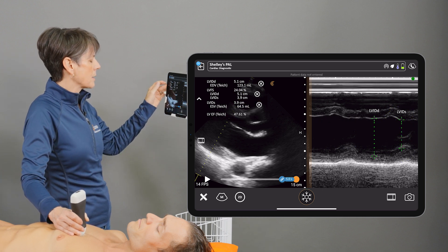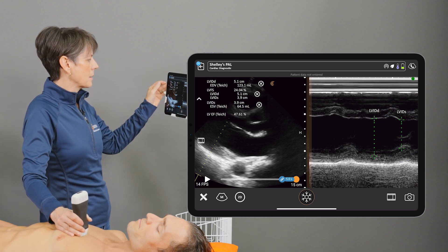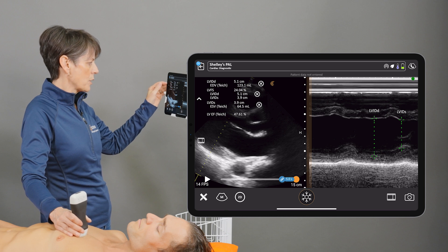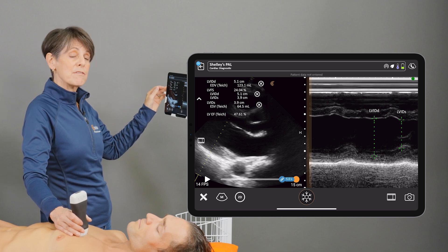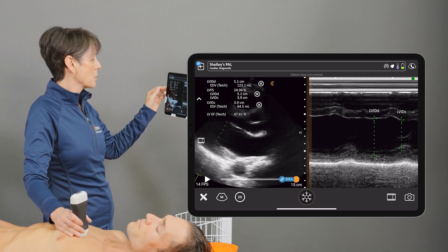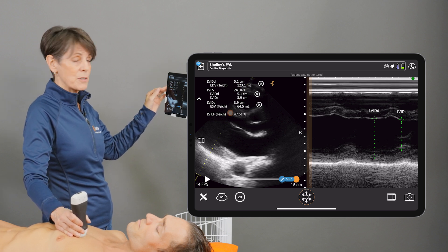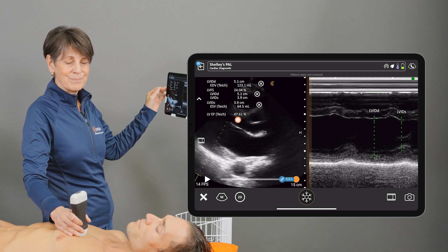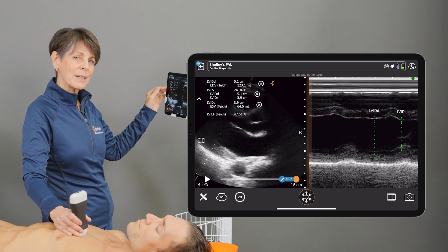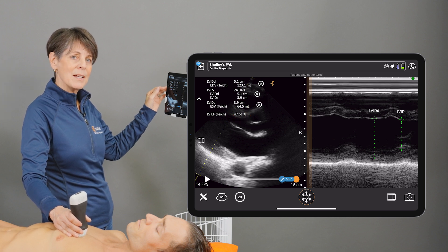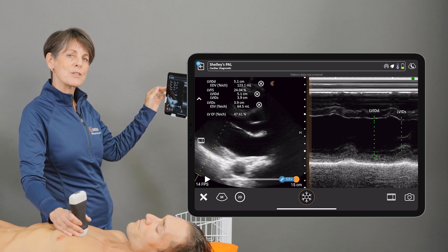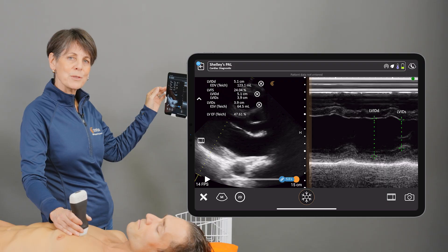You'll see that the Clarius app calculates the fractional shortening and then from that also gives us a left ventricular ejection fraction. So there's a quick and easy way to get an ejection fraction from the parasternal long axis view.